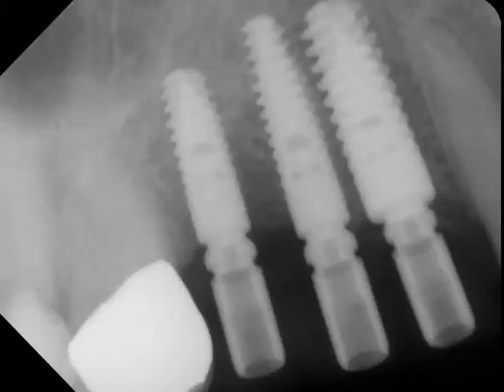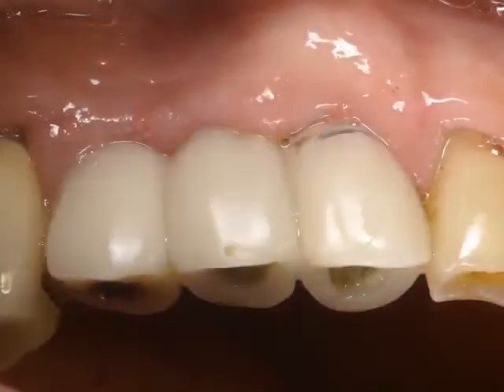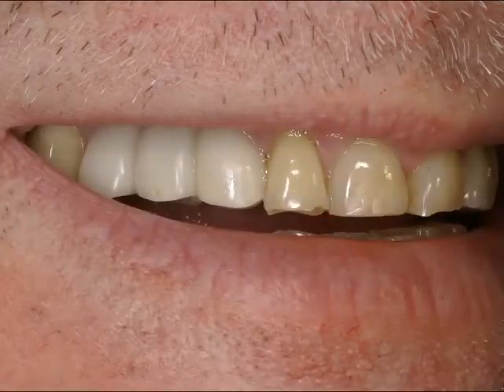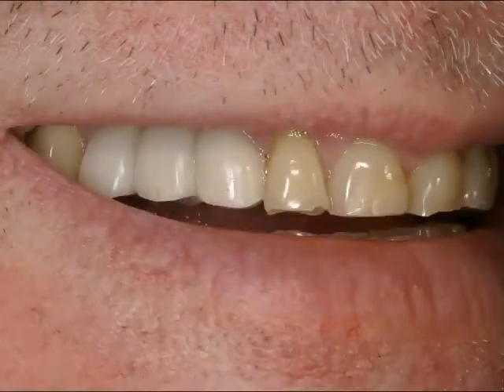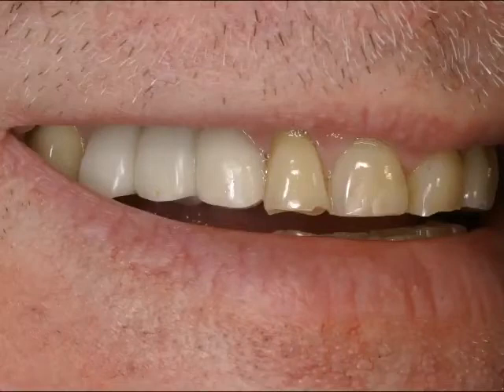Here you can see the pre-op x-ray with the decayed distal aspect of the canine, and immediate post-op with the Ankylos implants in place. And you can see that we took this from the optical scan to the mouth, and this is now at 2 weeks post-op, being able to finalize the treatment from the scan to the plan to the actual three-dimensional rendering of a treatment plan in the mouth.